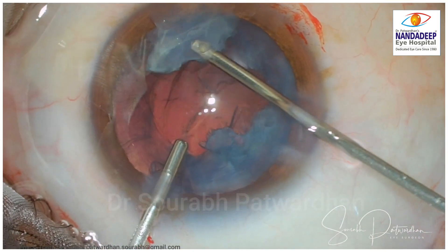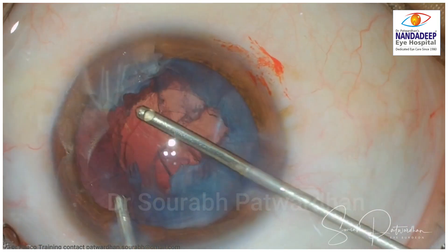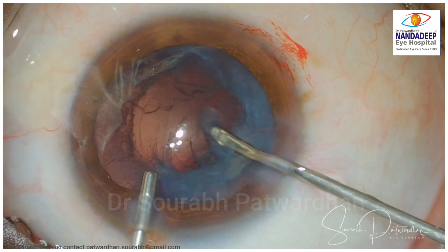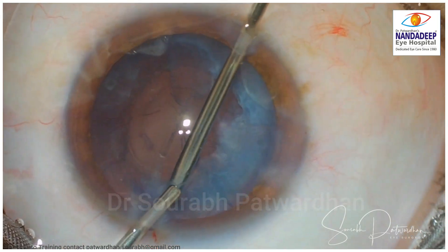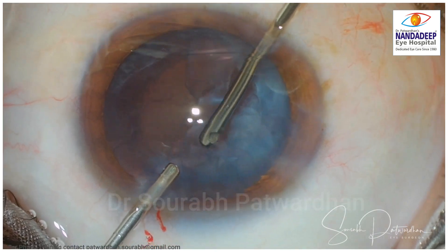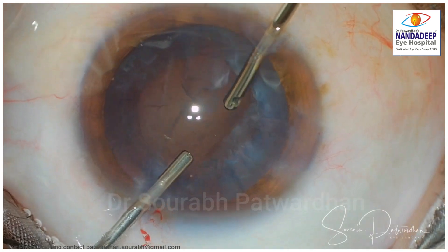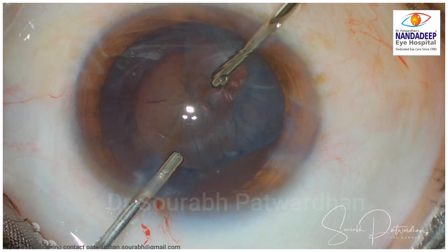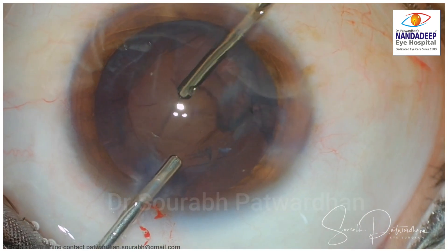Going through the main incision helps avoid the nucleus piece going into the vitreous because there is a pressure gradient formed between the anterior chamber and the main incision — fluid will pass through the main incision rather than pushing nuclear pieces into the vitreous. Whenever there are free pieces and you want to take them out with the vitrectomy probe, it is better to use the main incision, taking care that the AC doesn't collapse. Once the separated pieces are taken out, I go from the side incision to aspirate the epinucleus and cortex using the vitrectomy probe. Here the nucleus is very soft and can easily be cut using the vitrectomy probe. If it is hard, we may have to enlarge the incision or make a scleral tunnel.